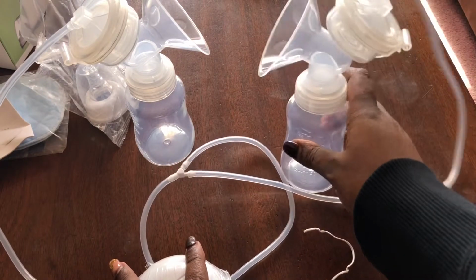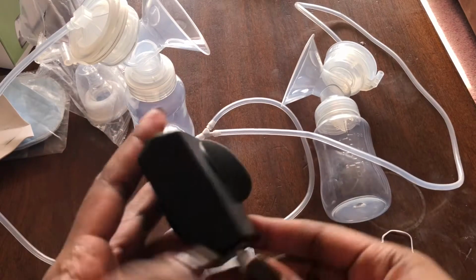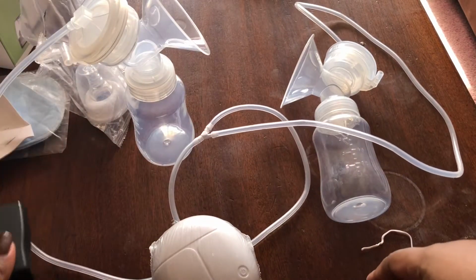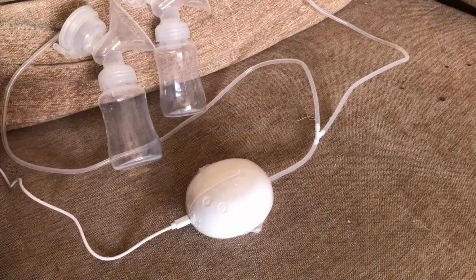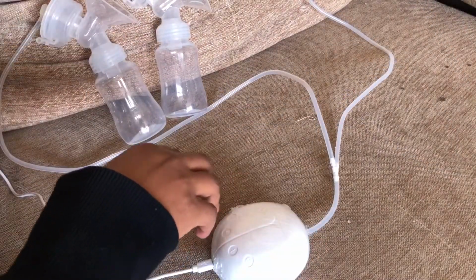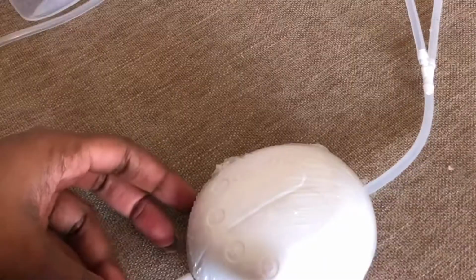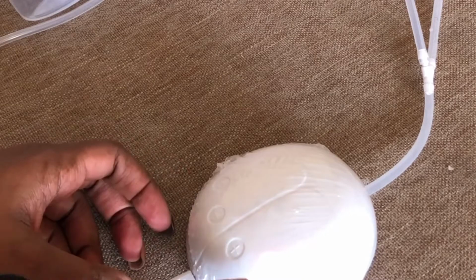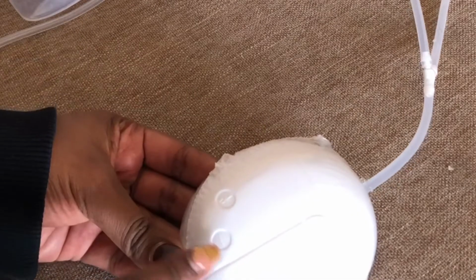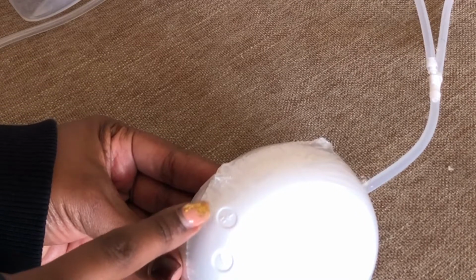That's it, guys. So you use this part, you connect it to a source of power. So I'm going to show you, and that is done. So yeah guys, I have connected it to my source of electricity, and there you go. So you have the on button. When it's on, it should be red in color. Then there's plus, minus, and then there's this. This is for stimulation and expression.